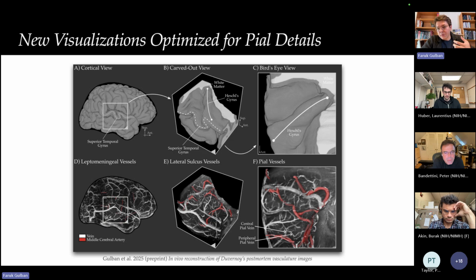And by the way, I can also color the arteries separately from the veins, because when you have the whole brain vascular data, arteries also do appear, at least the large arteries. You can follow them anatomically and figure out whether they are really arteries or veins. So based on that information, you can even separate to some degree big arteries and big veins, and you can see the small veins. Arteries are often invisible in this resolution.